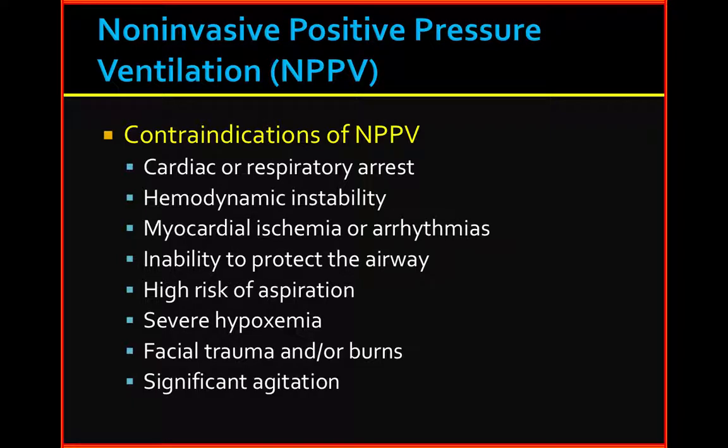It's a simple thing. CPAP is most often used in patients with obstructive sleep apnea who have collapse of their airway soft tissues during sleep, leading to airflow obstruction. CPAP has been described as an airway stent to keep these tissues from collapsing.